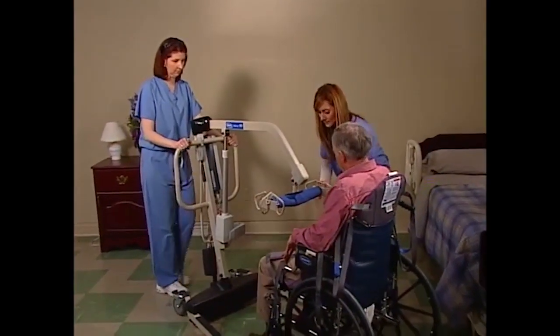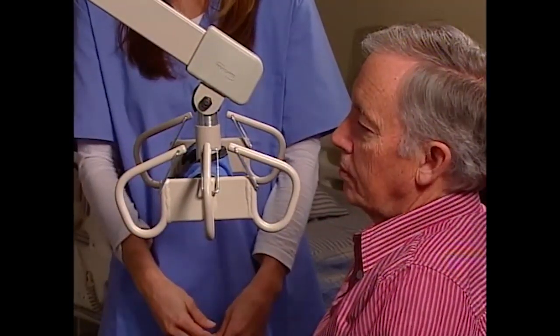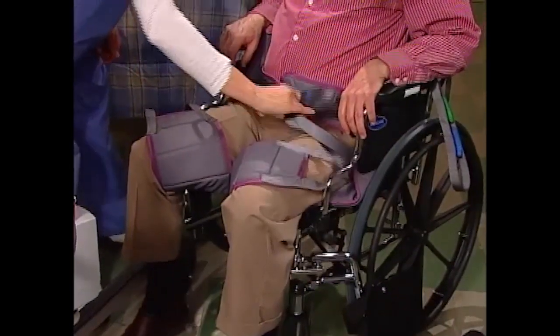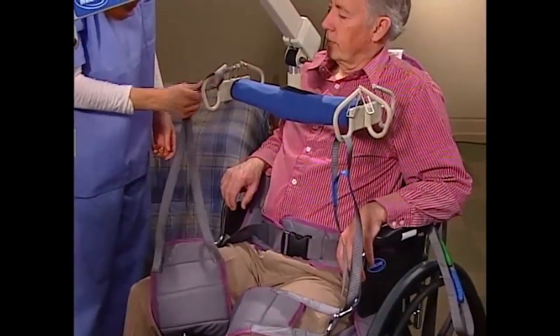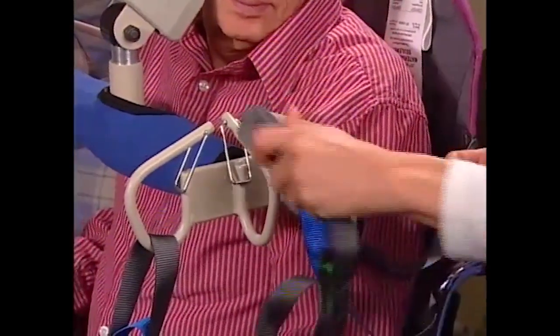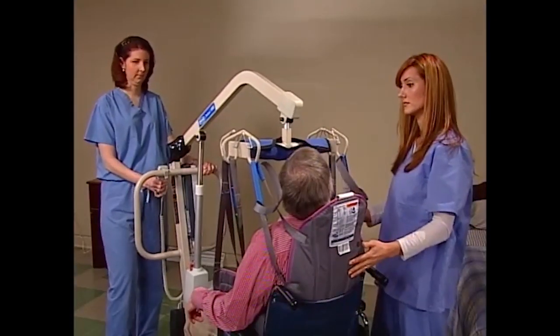Position the lift so it's over the wheelchair. Position the swivel bar so that it's parallel with the resident's shoulders for proper attachment. Lower the boom so you can attach the sling to the swivel bar. Lock the rear casters to secure the lift. Then attach the sling. First, attach the straps that are by the resident's legs to the front of the swivel bar. Attach the top straps securely to the swivel bar hooks that are closest to the resident, making sure you use the same color straps for both sides. Next, attach the center straps to the swivel bar. Unlock the rear casters. Press the up button on the hand pendant to elevate the swivel bar and put a slight amount of tension on the sling.